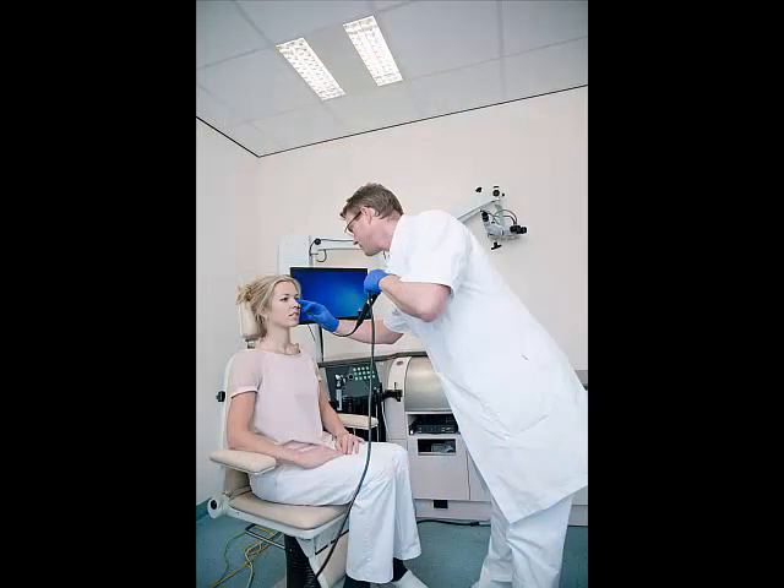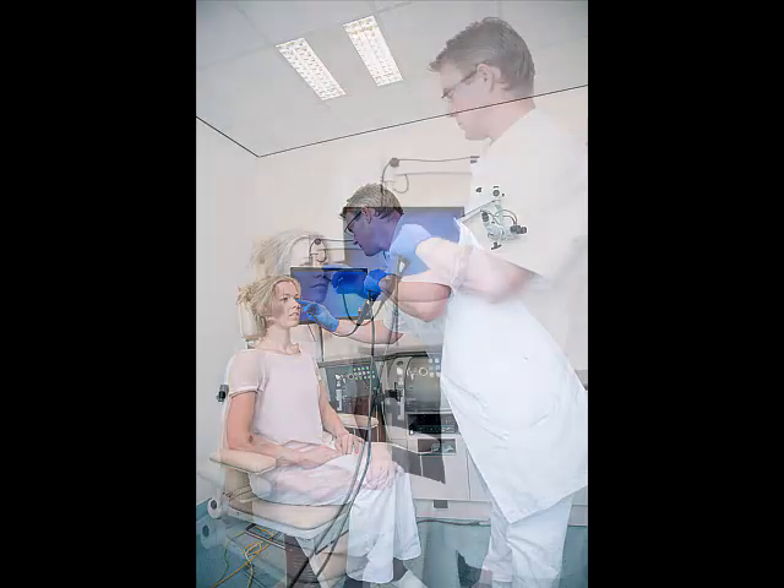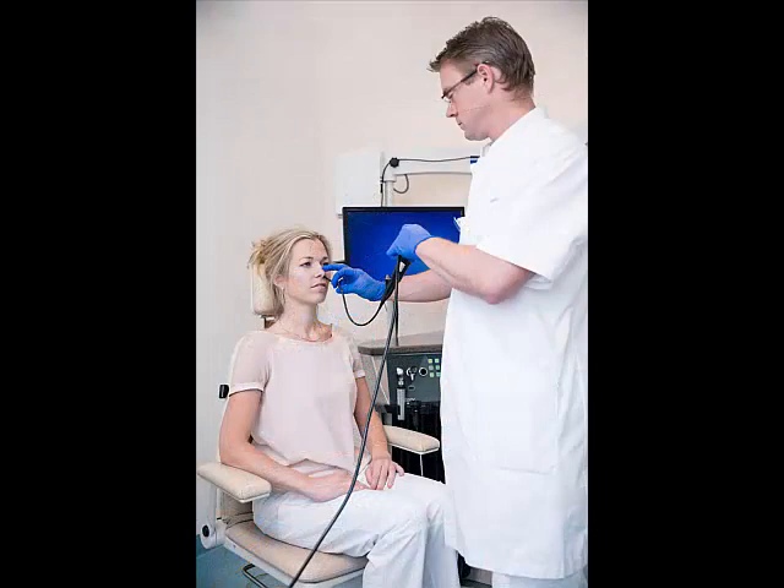The examination can be performed in the seated or standing position. Be aware of a good posture with a straight back and fixation of the hands on the patient's nose. Make sure that the endoscope is in a straight line, which will result in easier turning of the endoscope when passing the nasal cavity and examining the larynx.